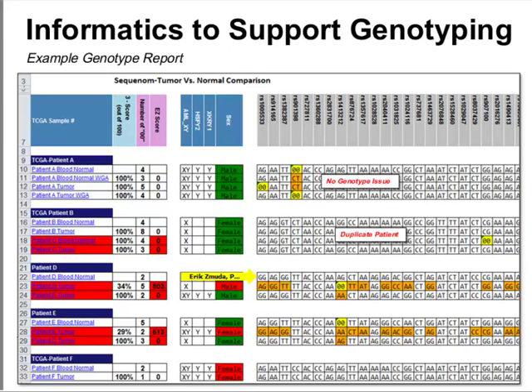The molecular sex matches the clinical sex, and so that would flag us to do an investigation into how we received two samples that have the same identity. And in almost every case, it only required pulling the path report, and upon inspection of the path report, you could clearly see they were from the same patient.